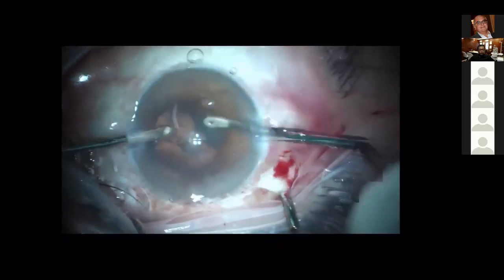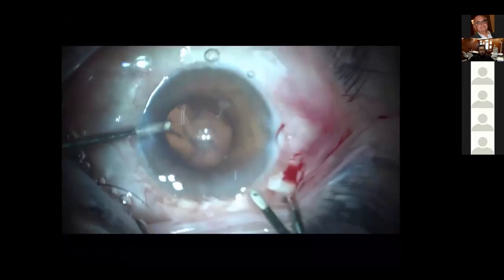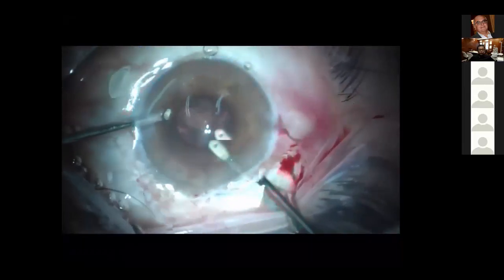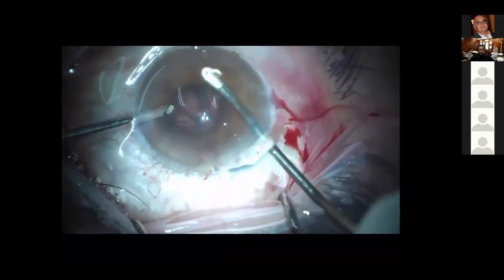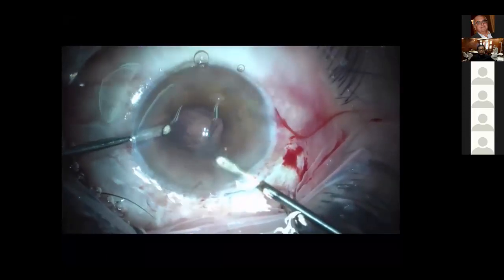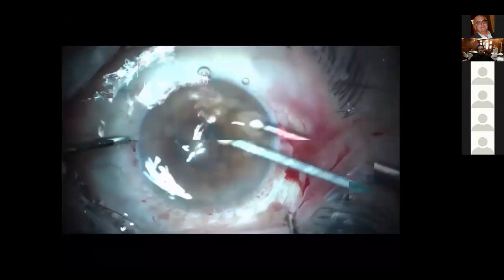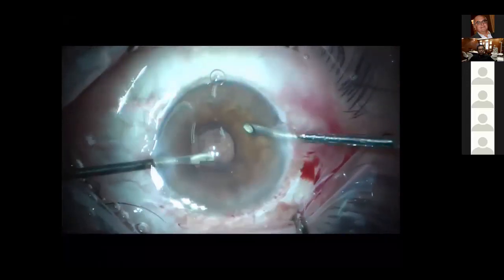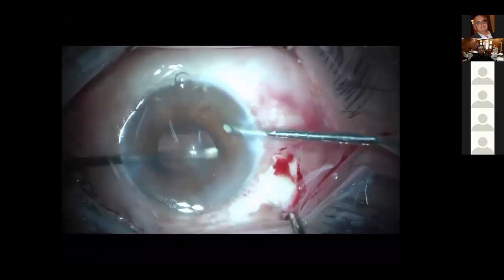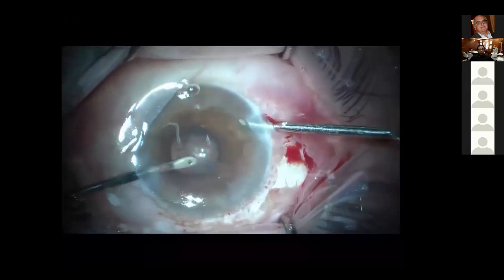And scleral tunnel techniques, I've been performing quite a number of such cases, and they nearly induce no astigmatism post-operatively, as the incision is inside the sclera, and the rest of the wound is performed in a lamellar fashion in the cornea, which acts exactly as the laser or LASIK flaps, so it induces minimal or no astigmatism at all.